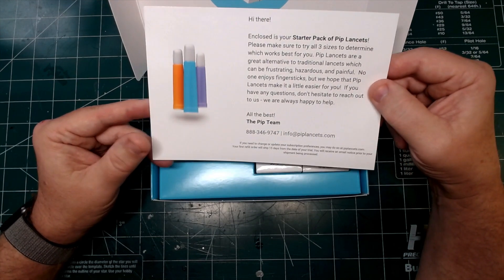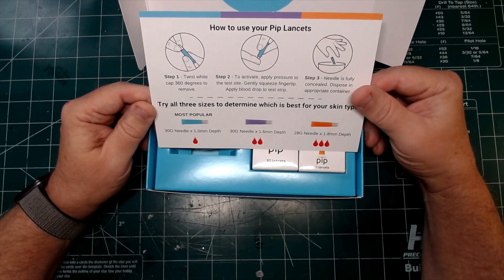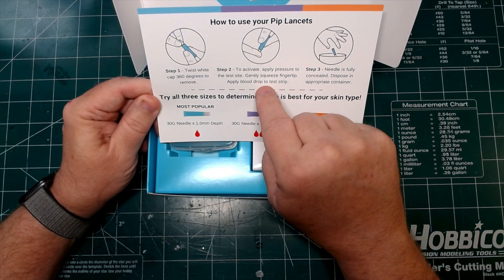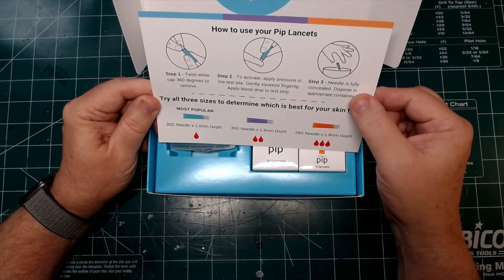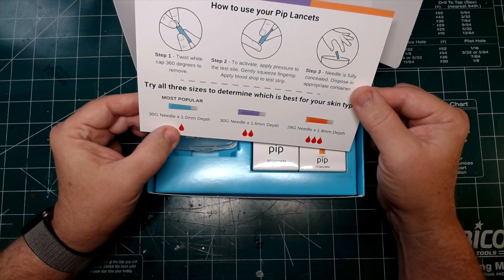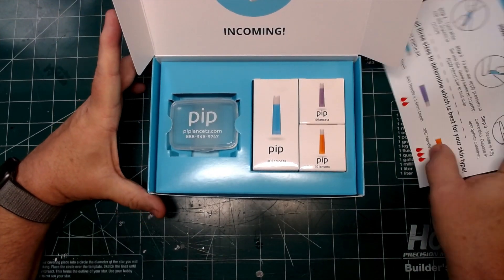Now, that is one of the big selling points of the PIP lancet — they claim it is less painful than traditional methods. One of the things that really attracted me was that there's no setup. You just take the cap, twist it off, press the lancet up against your finger or your test site, push, get your blood drop, and throw it away. I ordered the blue, and I'm going to be trying those first. They also have the purple and orange, and they give you some of all of that in the set.